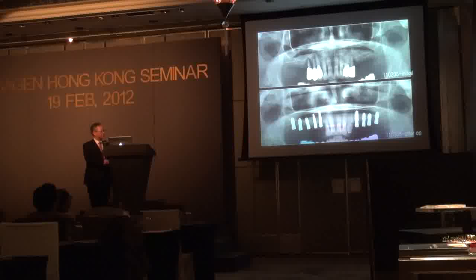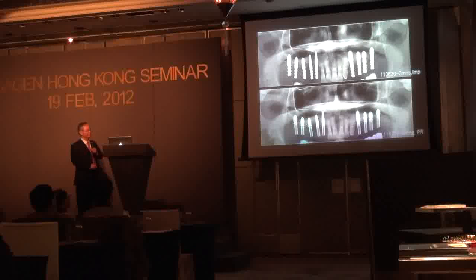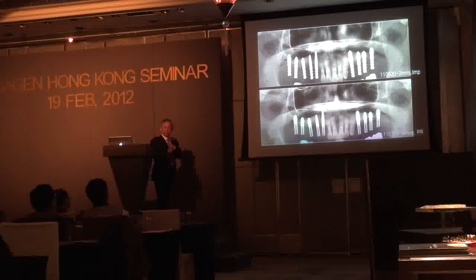So on the X-ray, this is after surgery. It's because of initial stability, as I connected healing abutments immediately. The healing abutment is longer than the implant itself. And then, see, 3 months later, I took impressions. Only 3 months later, can you take impressions?